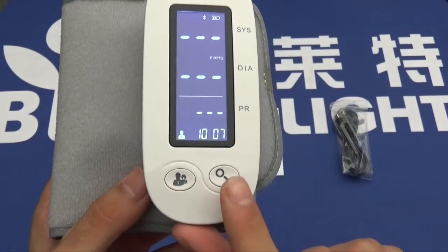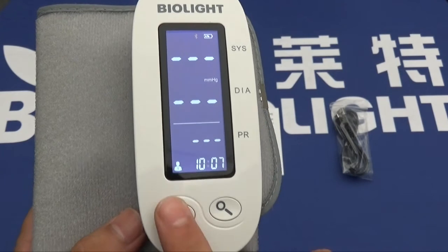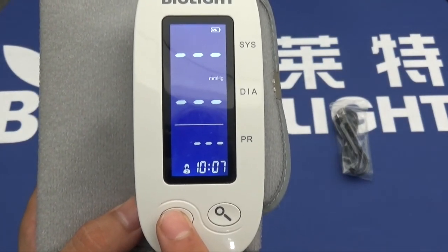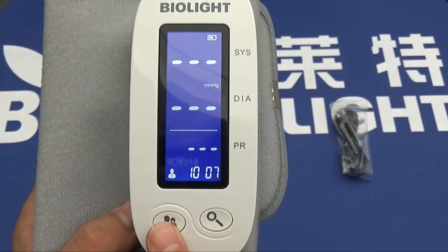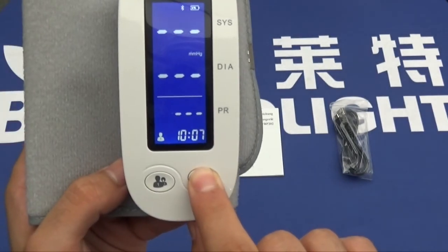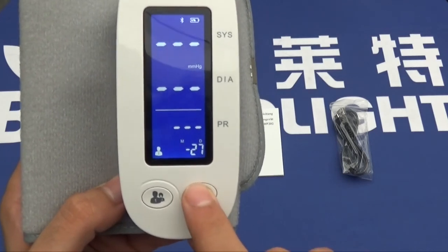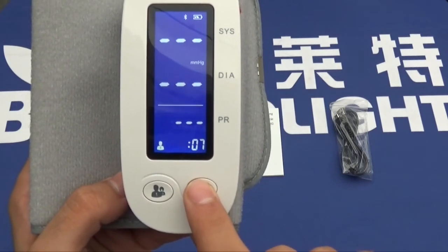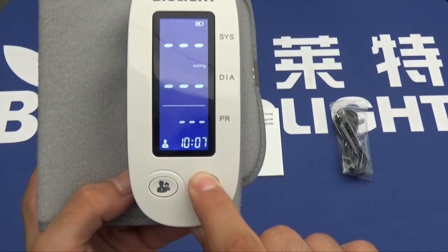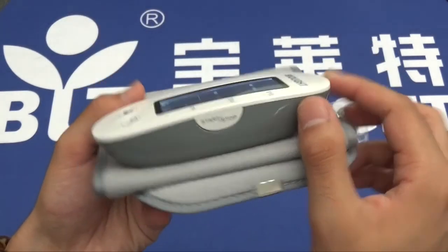There are two buttons on the bottom. One is to change the data entry — so patient one and patient two, or person one, person two — just press it once. It changes from person one to person two, and back to person one. The other button, press and hold for three seconds, allows you to change the date, the year, and the time. Press and hold again for three seconds and back to where we started. To turn off the device, same button, simply press and hold.